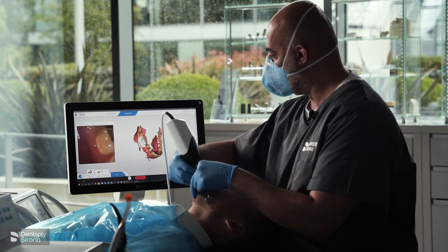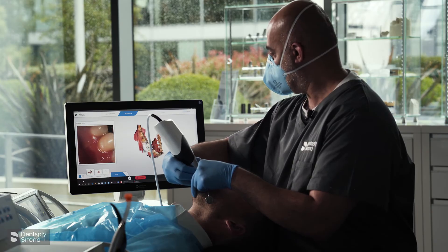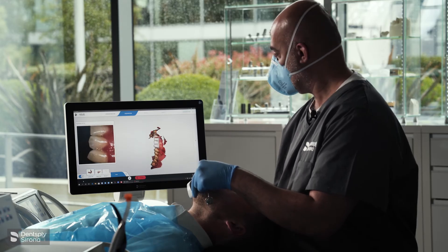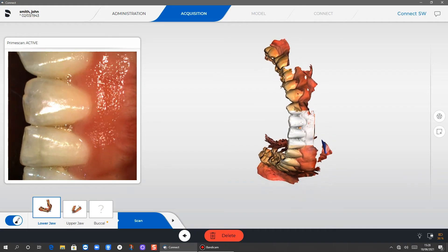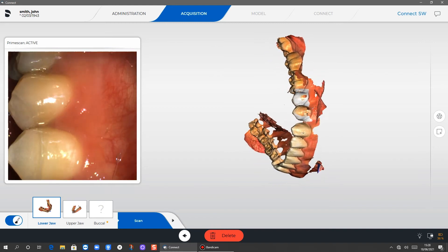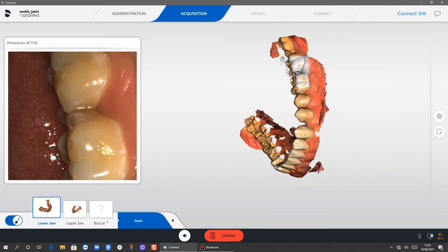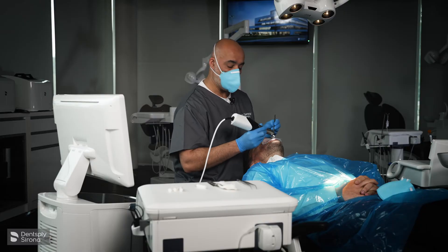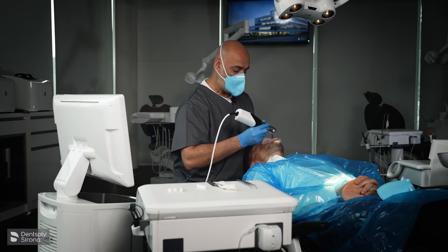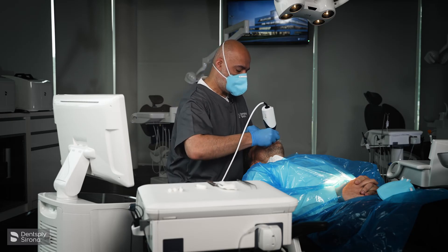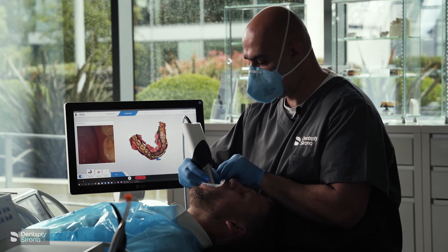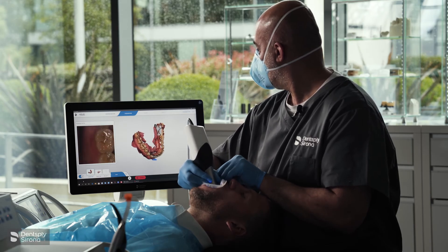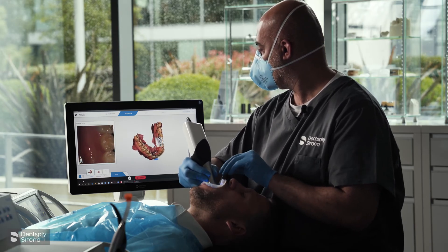I'm keeping the teeth in the center of the screen, then going back in again to complete the buccal scan. Now I'm going to move to the lingual area, keeping the tongue out of the way using my mirror. Again, to activate the scan it needs to stitch together, so I need the lingual — here's the lingual area of the five, six, and four.